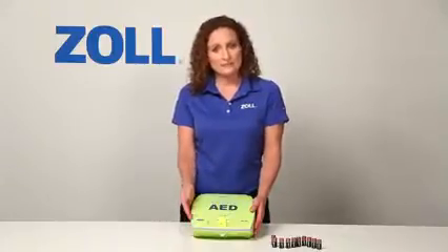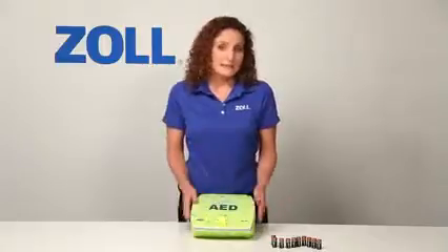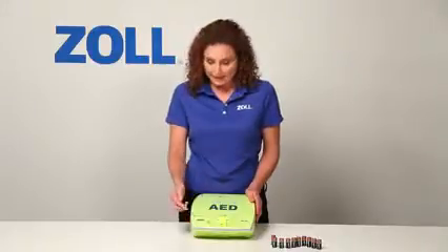Notice how easy it is to inspect the readiness of the AED. Check the expiration date of the pads by looking at the date printed on the tag that extends from the lid. You can conduct a self-test of all critical components by pushing the on/off button down and holding for 8 seconds. The AED Plus also performs the same test automatically on a regular basis, presenting a green check if it passes or a red X with a beeping alarm if it fails.